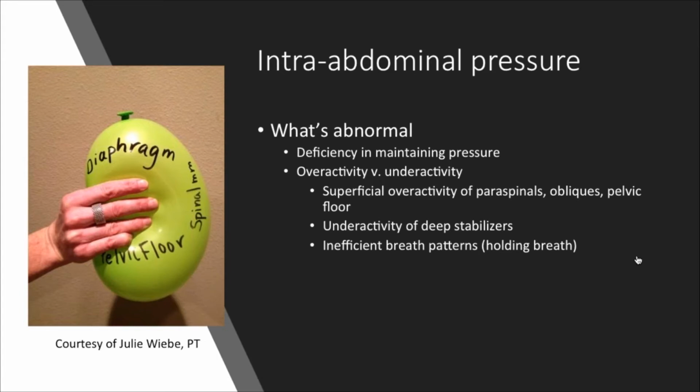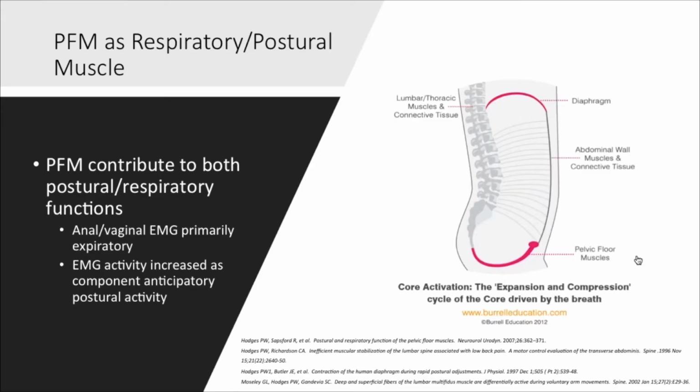So it isn't necessarily all about the contraction, but we need to go back to the true definition of pelvic floor muscle training, which is the contraction and the associated relaxation. Now, if we take a look at this from an abdominal pressure standpoint, we're looking at pressure coming from above and maintaining that, and also the pelvic floor supporting from below. So we want to look at where there's overactivity and underactivity.